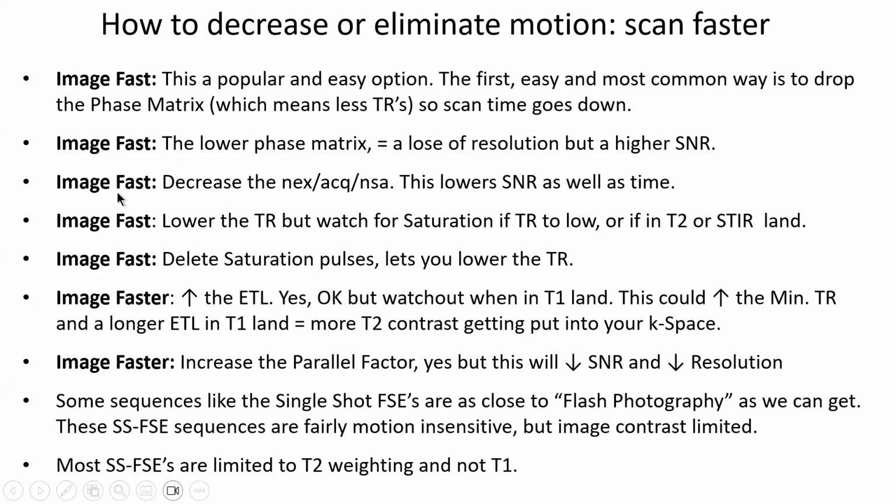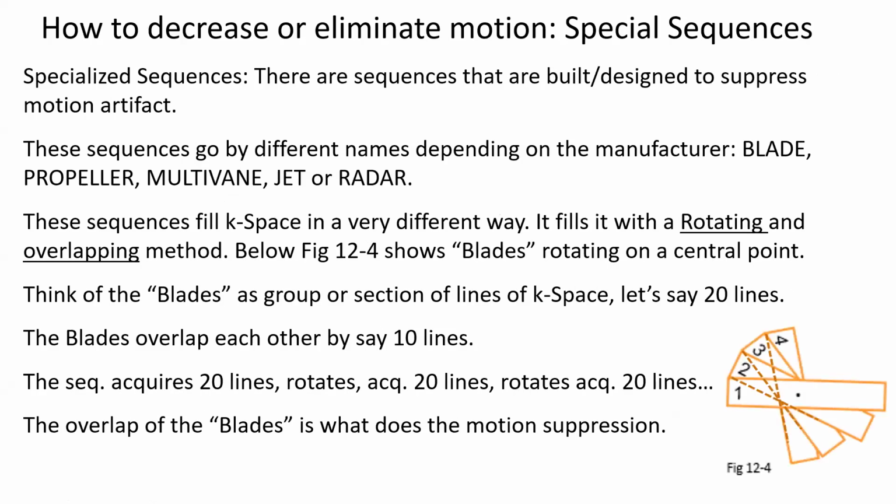of your action. So if you decide to drop your NEX, you're going to lower your scan time, but you're going to drop what? Signal to noise. So this is where you need to know what your consequences are.